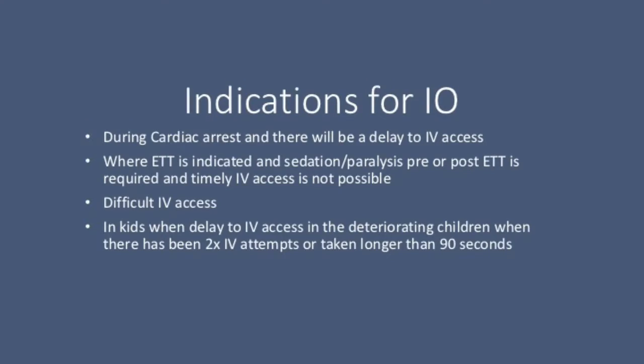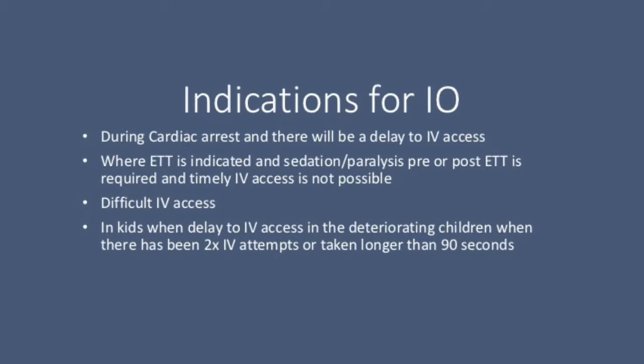Hi, I'm Matt Collins, and today I'm going to be demonstrating the insertion of an intraosseous needle using the Easy IO gun. Firstly, let's start with indications for IO. During cardiac arrest and where there will be a delay to IV access.